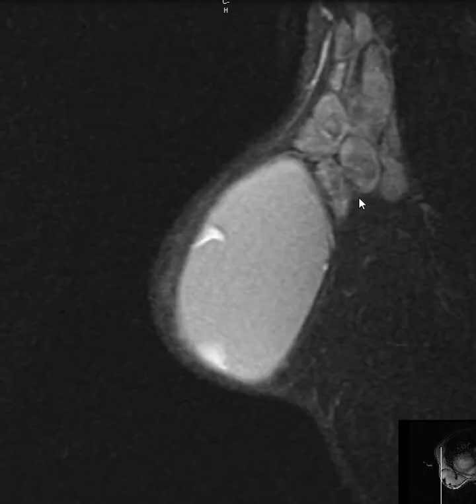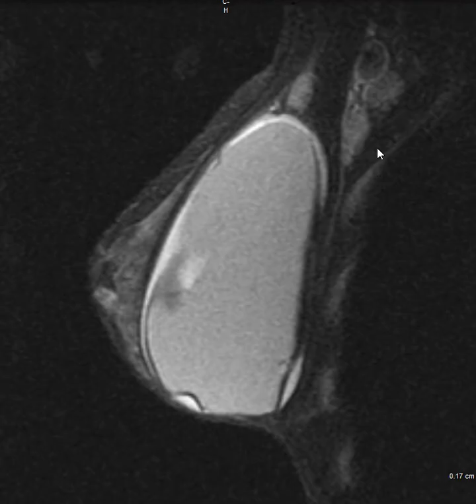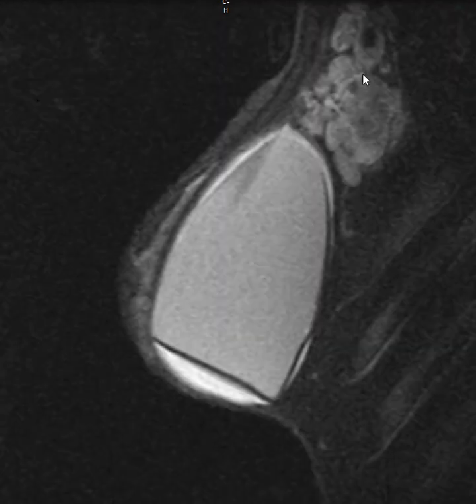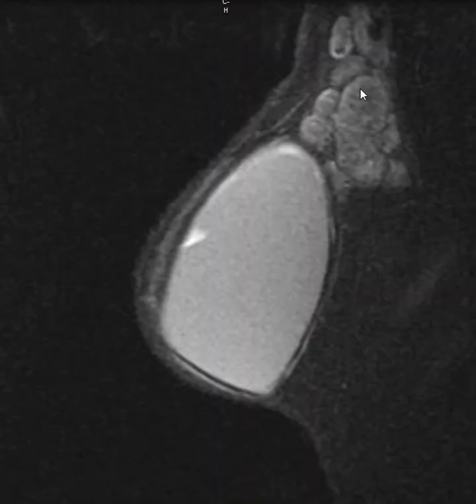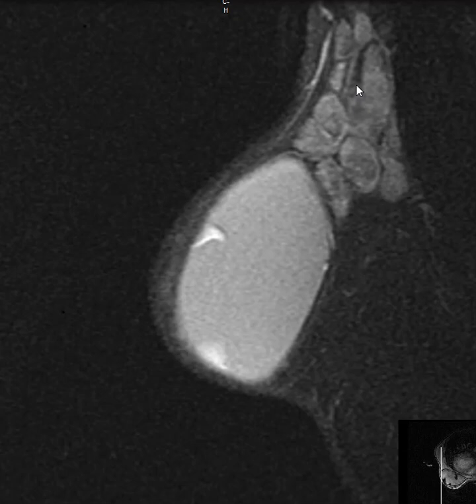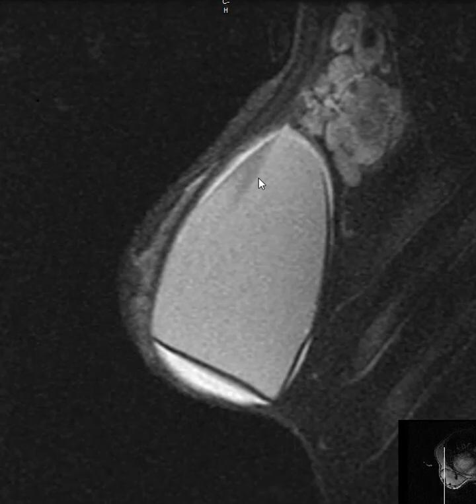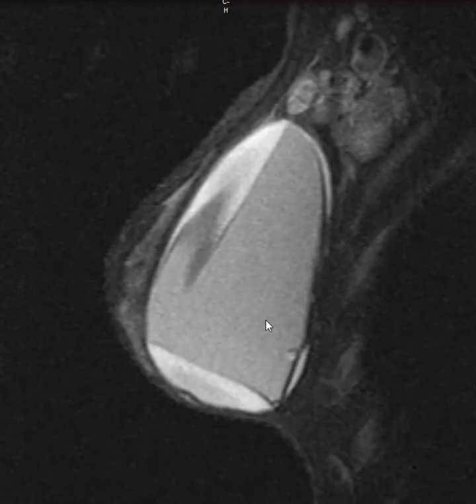These are massive lymph nodes. The whole axilla is just chock full of these big, huge lymph nodes. With implant rupture — silicone implant rupture — the silicone can be picked up by the lymph nodes, and they can become inflamed and enlarged. So this is probably a case of silicone lymphadenopathy, massively enlarged lymph nodes related to a silicone ruptured implant. Thank you very much.